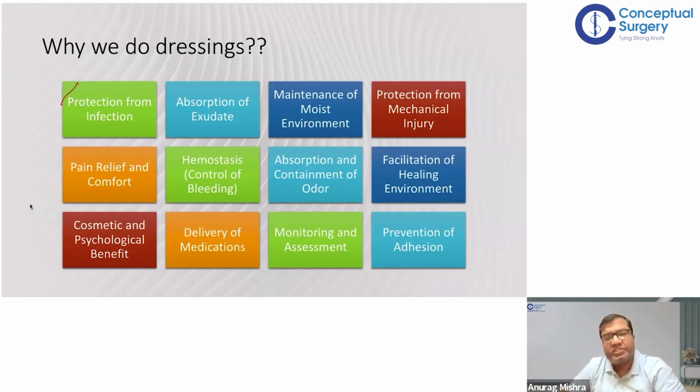Also, many times we use dressings to deliver some medicine. There are some medicated dressings, or we apply some medicine, then we apply a dressing over it so that the medicine stays in place and it gets to act on the tissue.